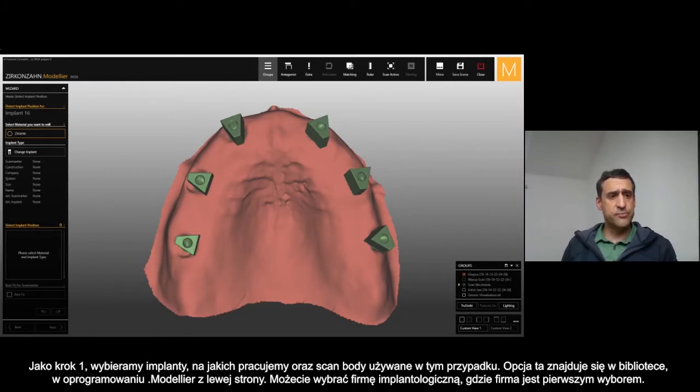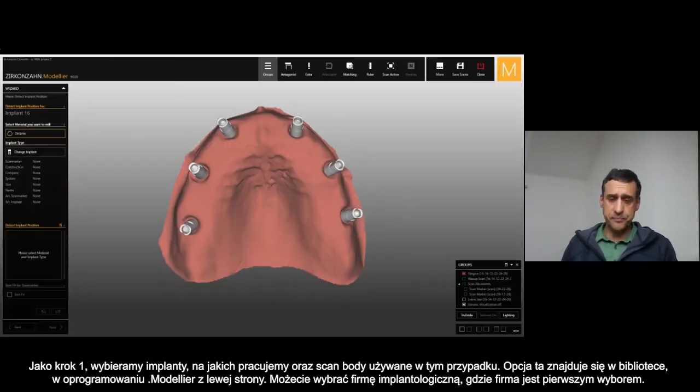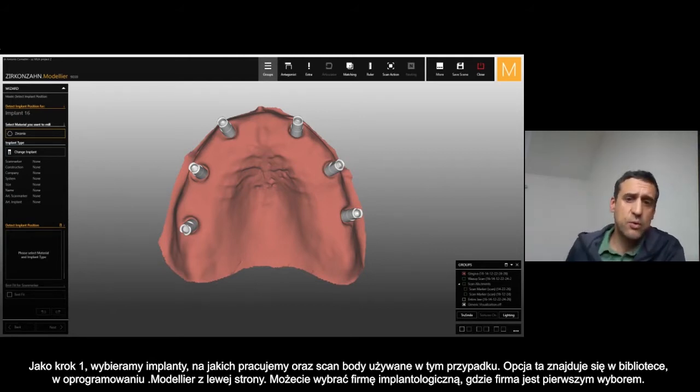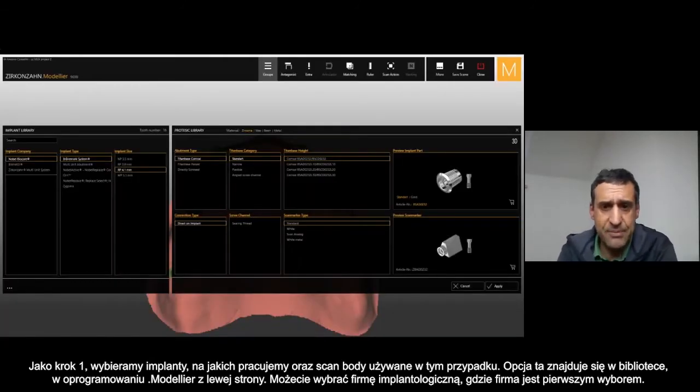As a first step, you have the choice to select different implants and different scan bodies that you were using for this case. Inside the library of our modeler software, exactly on the left side, the first choice is the selection of the implant company.